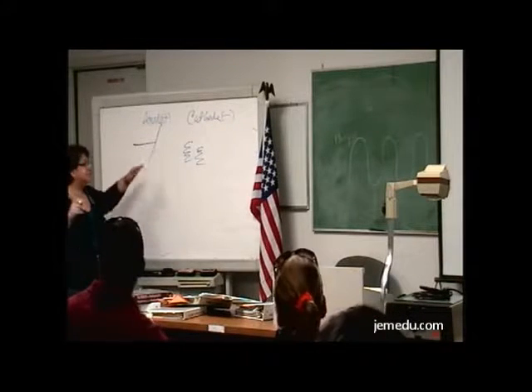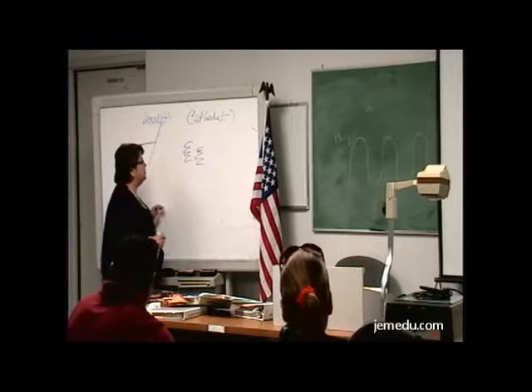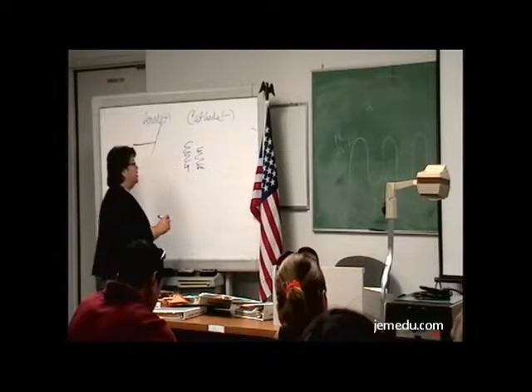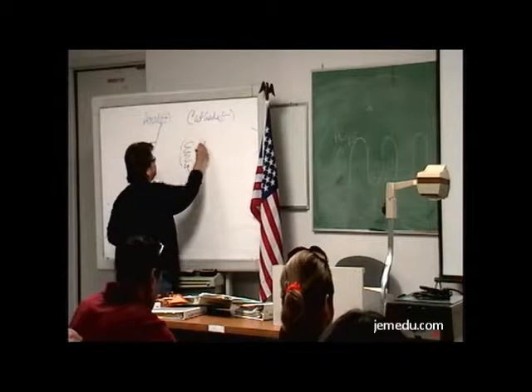Aha, see, somebody even said the wrong thing. What's on the cathode side? The filaments, what are their names? Large and small. We have two of them. What else is on that cathode side? Focusing cup. What's the focusing cup's job?